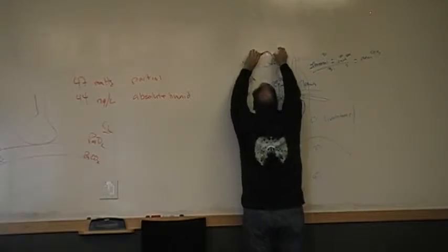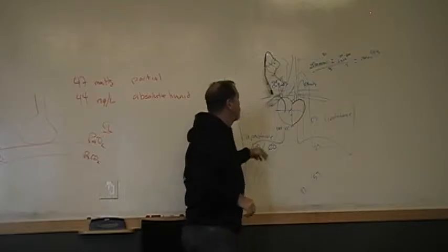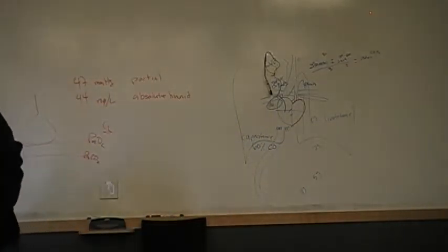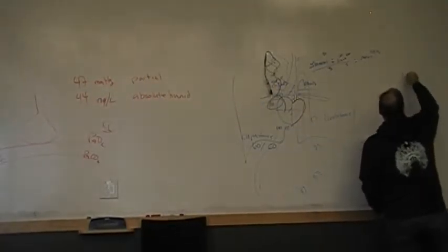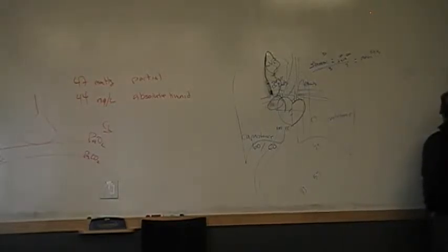So I'm going to stick that up there in his neck, and I'm going to start to insert it. You said right atrium? It's the same, right? So yeah, right atrial pressure, it's still 0 to 8, right, so CVP, 0 to 8 millimeters of mercury.